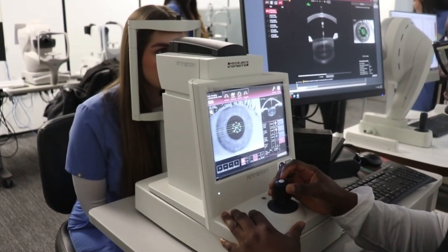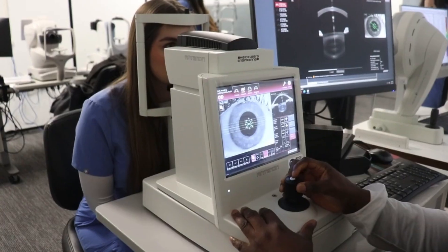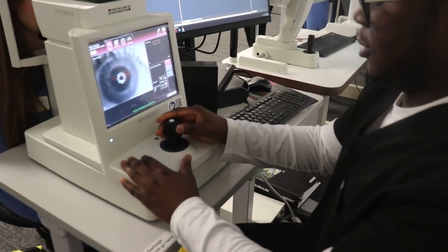The OCT is a non-invasive imaging device that works very similar to an ultrasound. Instead of using sound waves, the OCT uses light waves, so it's a very easy procedure to use. It captures a lot of information to look at the layers of the retina, and any condition that would benefit from examining those individual layers in more detail is something we might recommend an OCT for.